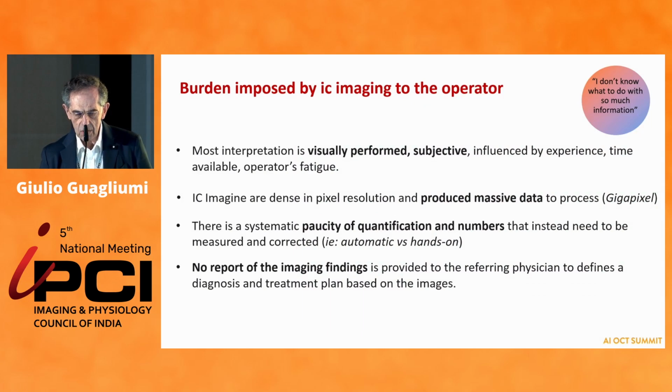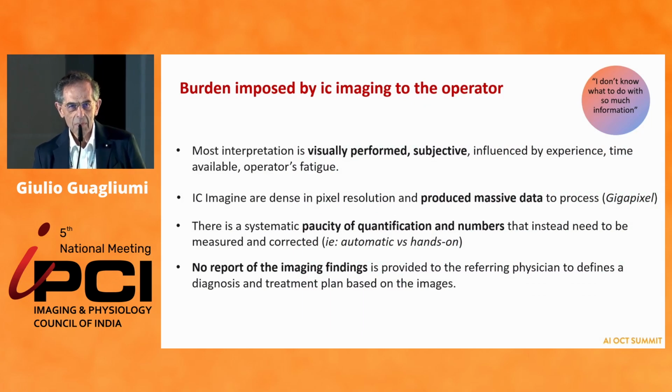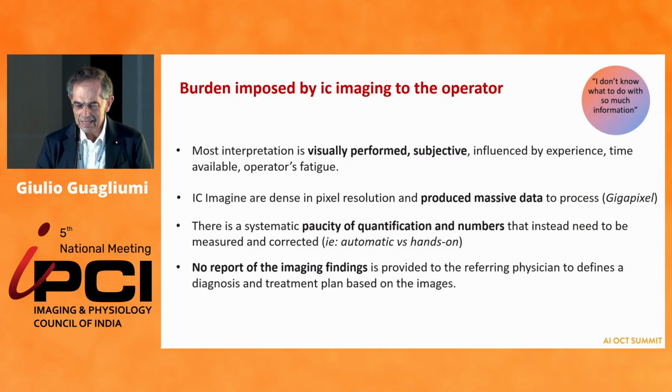So high resolution is extremely important. But high resolution is bringing some burden imposed by imaging to the operator. Which one? Most interpretation is still visually performed. It's subjective. It's due to the experience, to the time available, to the time of the day, meaning the operator fatigue. The higher the density of the images, the higher is the number of the pixel resolution.